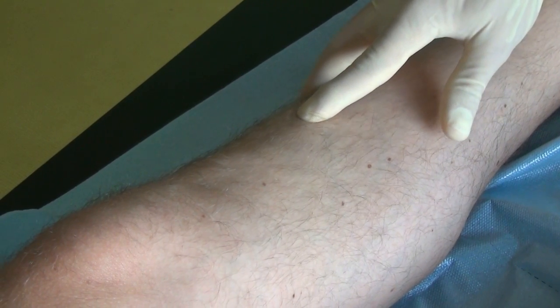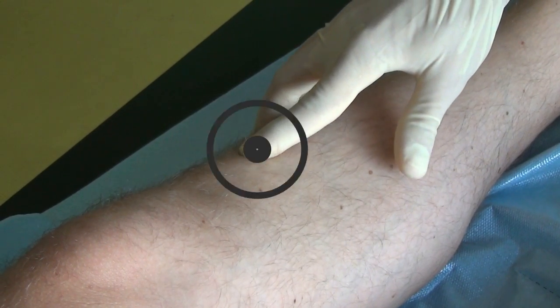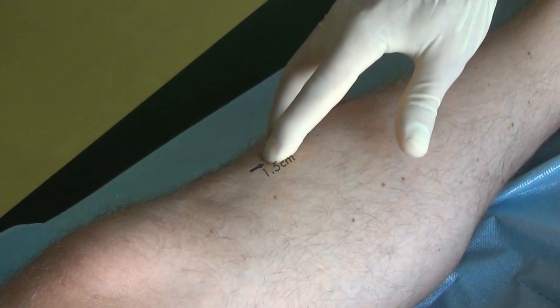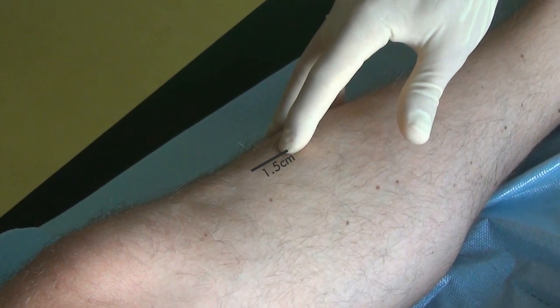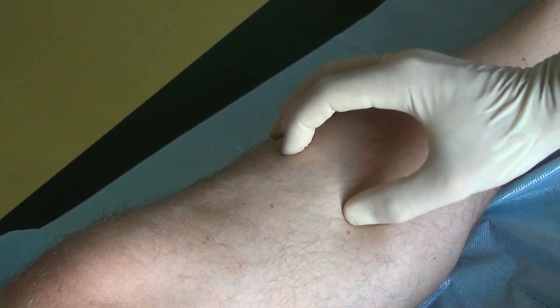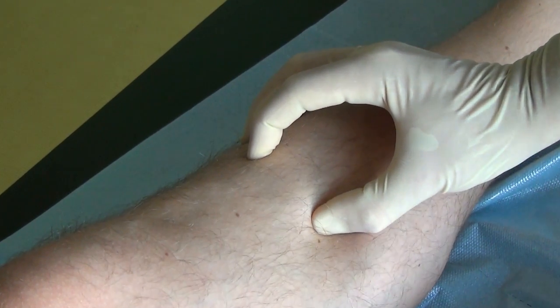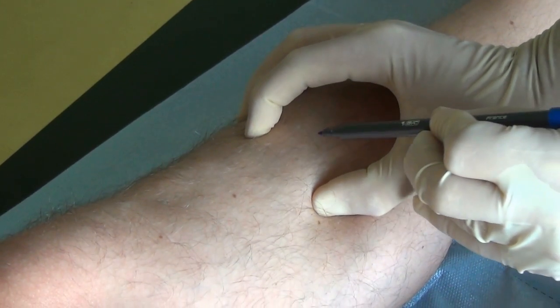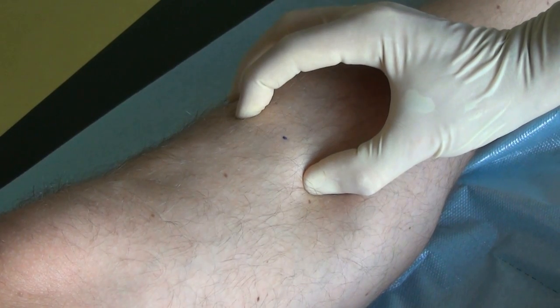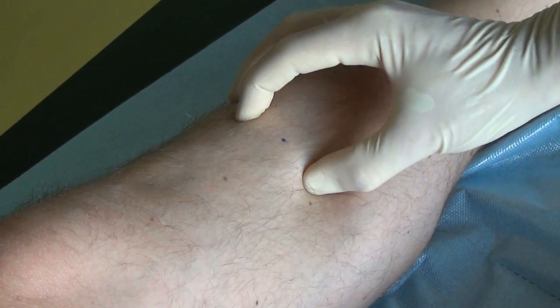Injection via intraosseous route can be given via the proximal tibial axis. Follow upwards on the tibial crest until the tibial tuberosity. The insertion site is located about 1.5 cm below the tuberosity, in the middle of the flat surface of the bone.